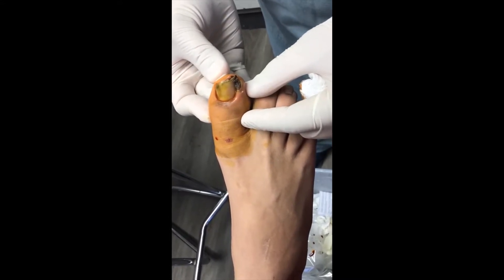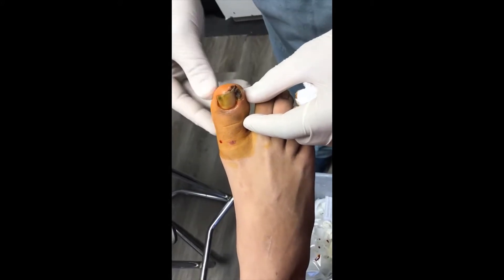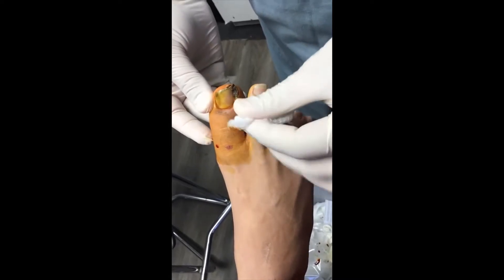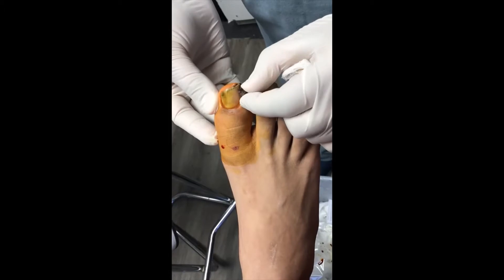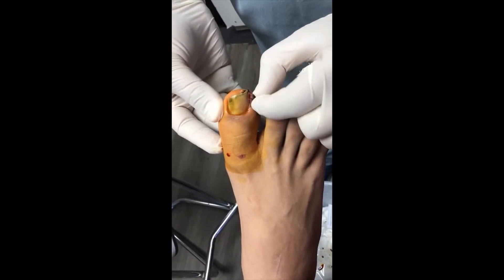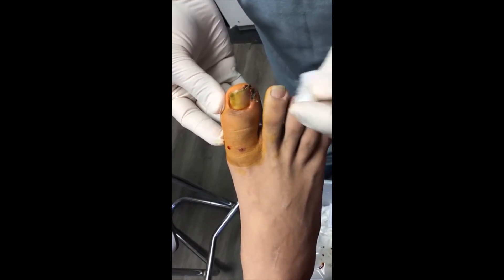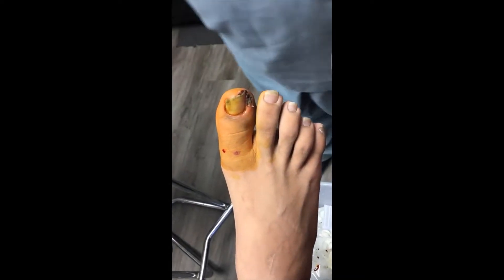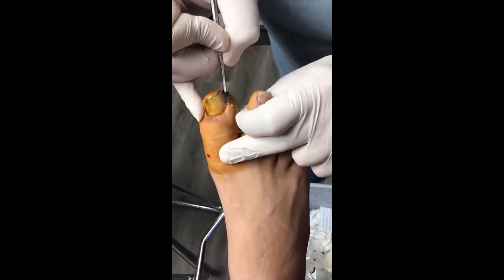When it looks this bad, we have to take the corner of the nail out, sometimes the whole nail. We're hoping just to take the corner out to clear the infection. You can see he's already numb. You can see this is what we call a pyogenic granuloma — it's pussy and inflamed.